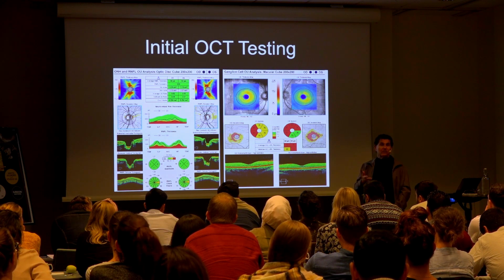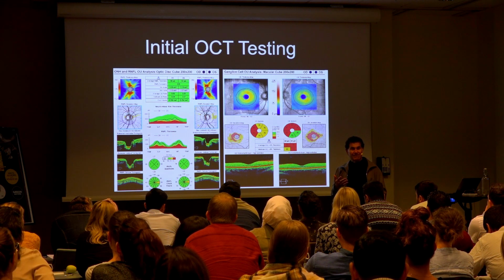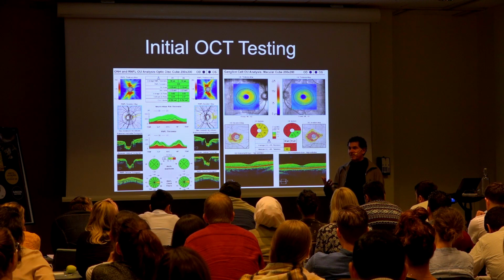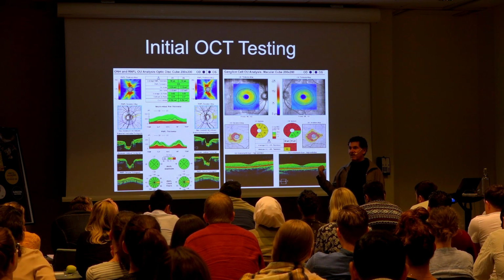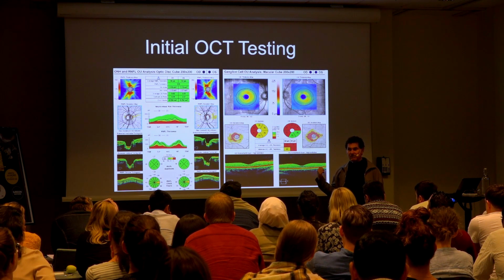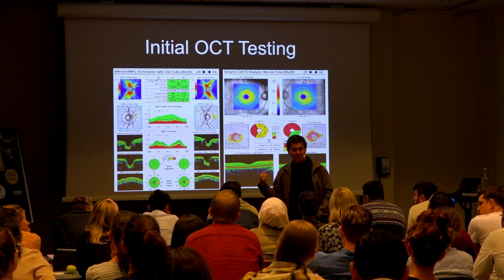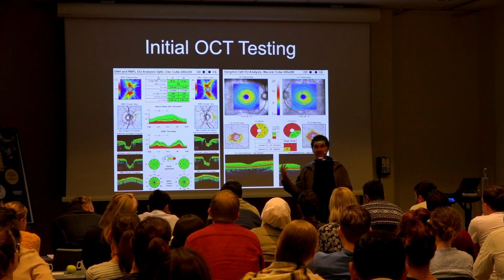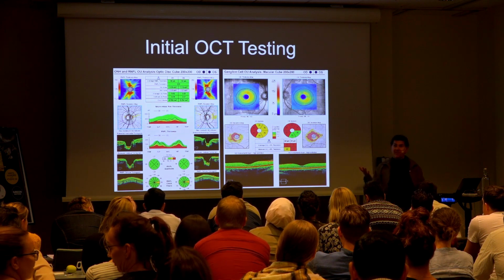Well, what was your original diagnosis before we had the homonymous loss? Optic neuritis, okay. But now we've got homonymous loss, but at the acute stage when she noticed it, she's already showing ganglion cell loss within just a day of when she had the symptoms. What does that tell you? Yeah. She probably had a previous episode of optic neuritis that never came to medical attention, and now we're seeing something on top of that. Very good.